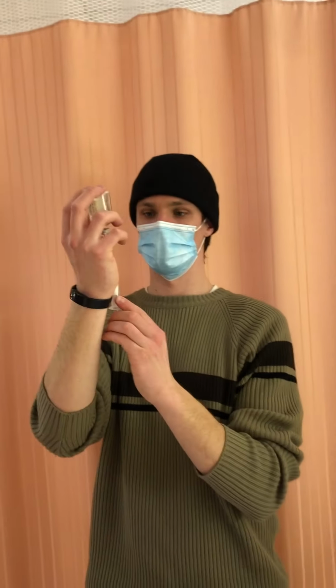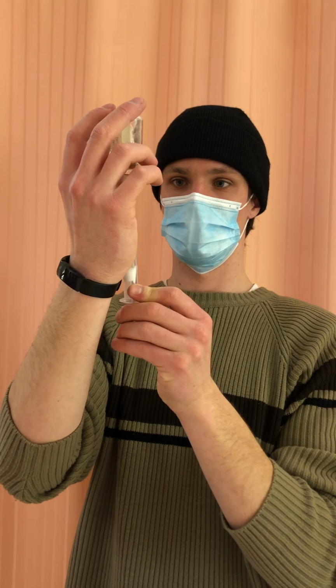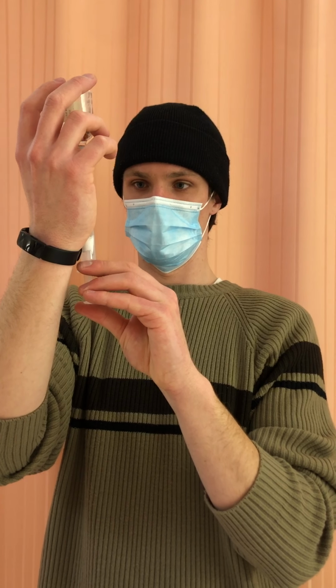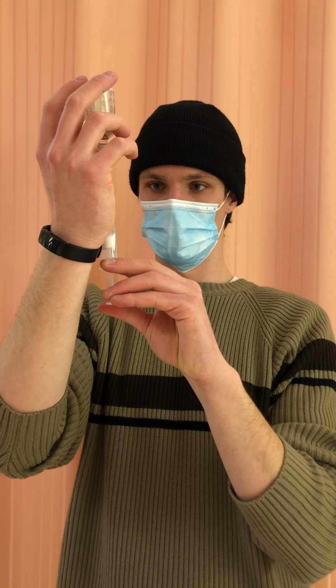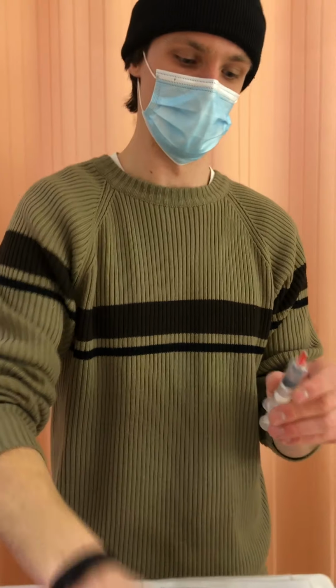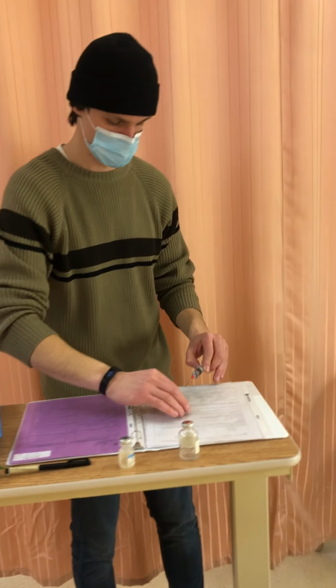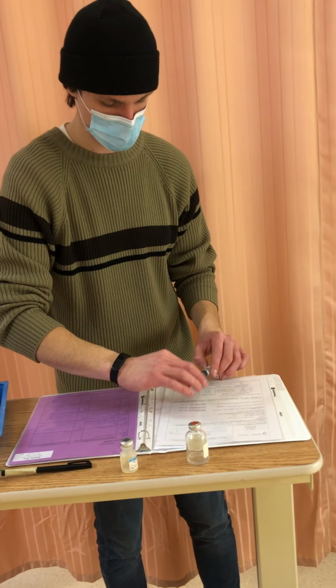And there's actually no bubbles. And then carefully open my set. Make sure it's closed. So I'm just recalibrating to 4 here. Draw it a little more. There you go, perfect. My Minibag. 4 milliliters of medication. Perfect. And I'm going to recap, and then connect my tubing. So I will hang this up for now.